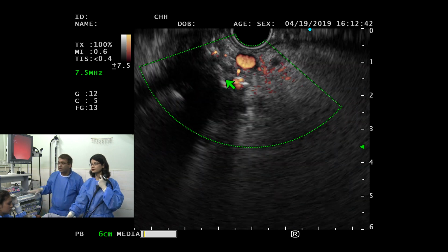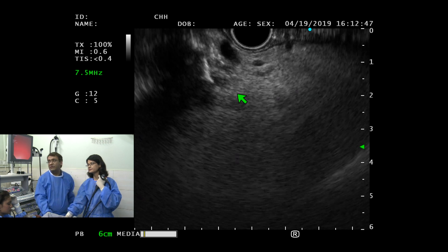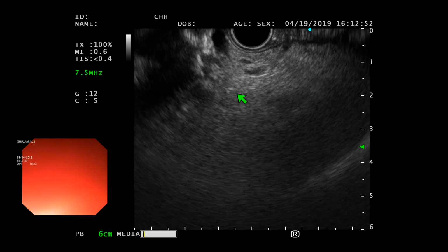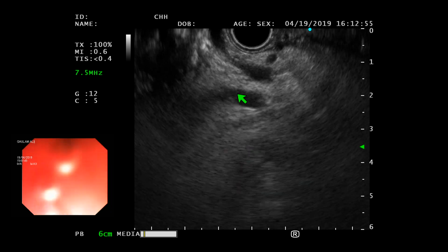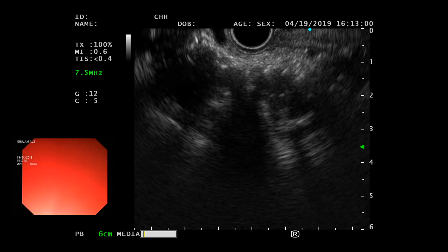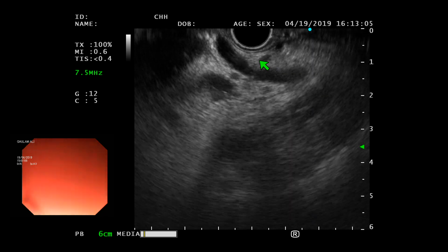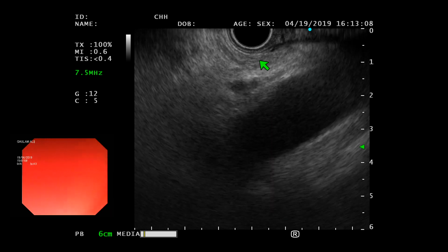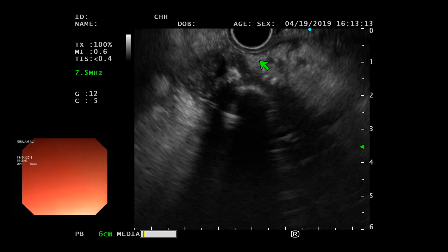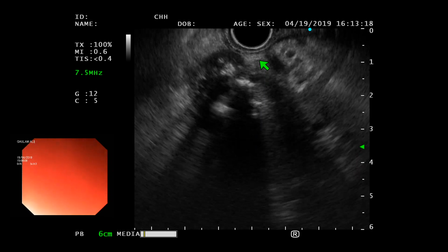these. You see the collaterals there. A lot of collaterals there. Okay. So rotate to the left. We have a node here as well. I think it's a part of the pancreatic. Let's just focus on one thing at a time, because otherwise it's going to be a lot of distraction. If we don't focus on the pancreas, we are going to say, what is this? What is that? So let's focus on the exam we are doing. Okay? Let's go back to the pancreas here. So a lot of calcification there. Okay.